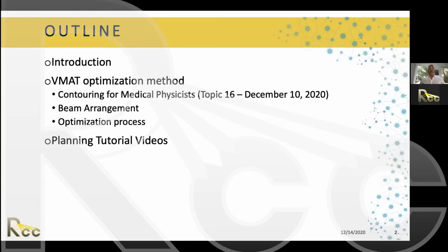I just want to say that we are going to explain one particular method, the one that Adam Shulman developed, and it was developed for this lecture. So we all kind of follow the same way to plan. But I'm sure if you are already planning IMRT or VMAT, you have your own methods, and we can always compare notes. As long as you have a good plan at the end, that's very important. But just to give you a consistent method, we wanted to have just one.